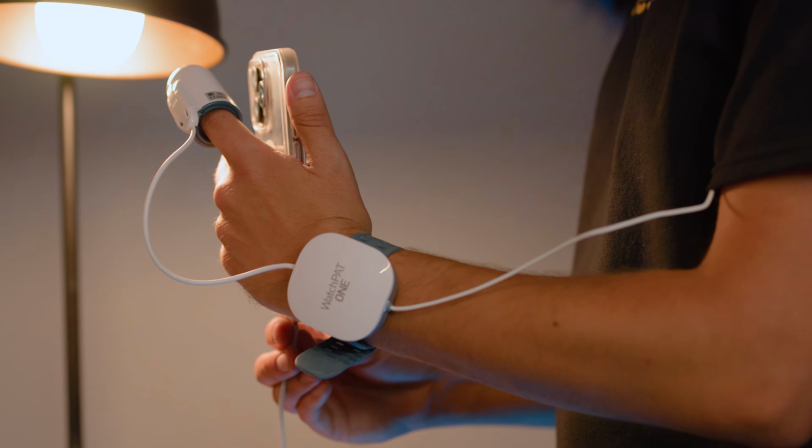And as with anything CPAP related, there are no clear answers about which is better. There are reasons for each, but as a rough guide, if your symptoms are not severe and there is no reason to suspect anything brain related, then an at-home sleep study is more comfortable, more convenient, and far more cost effective than a lab study is.